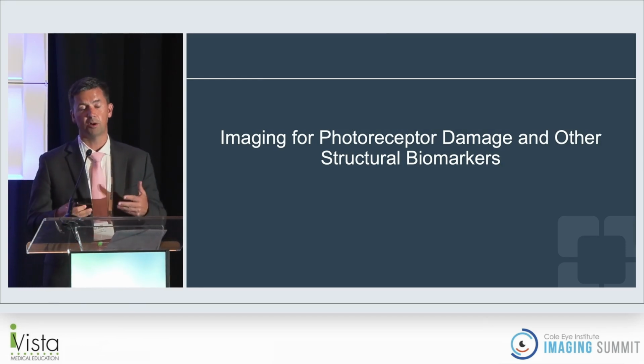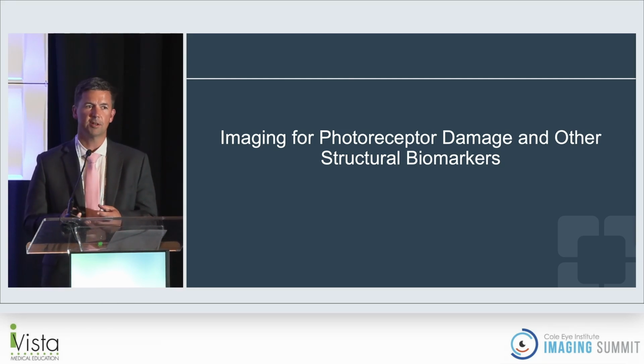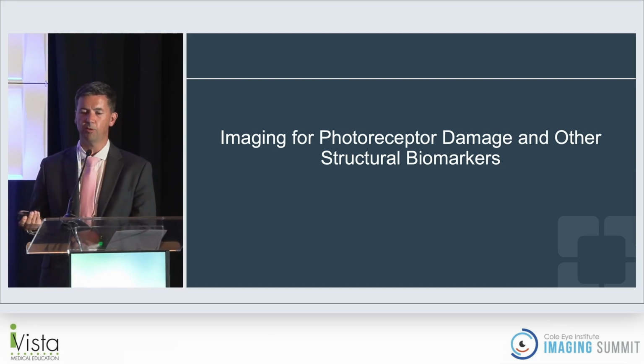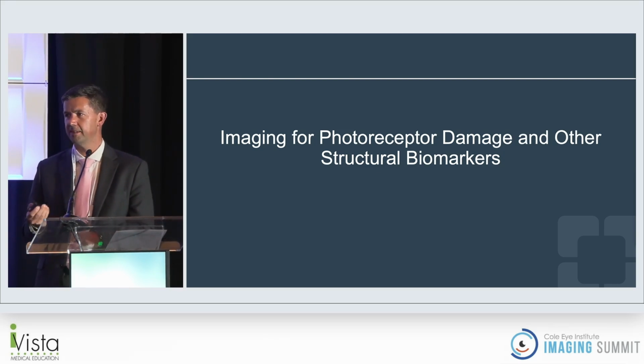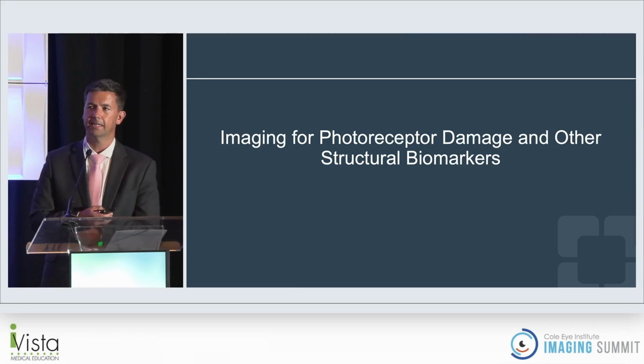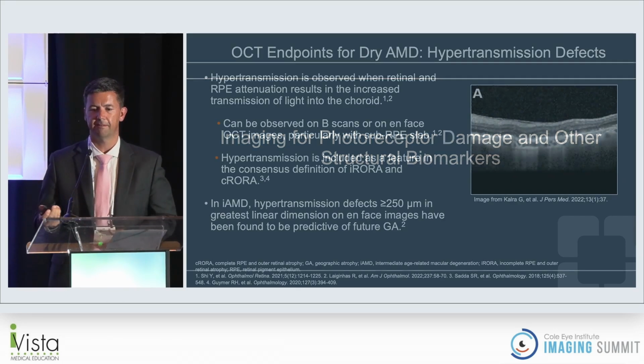The last thing I'm going to talk about is imaging for photoreceptor damage and other structural biomarkers that we're using more and more for OCT. The biggest challenge right now is that our commercial systems don't have automated platforms for doing this. So you really have to be looking for it from a qualitative side, but more than likely these tools are going to be available, whether as an add-on, using some of the new AI technologies where you upload the OCT, or embedded within the device review.